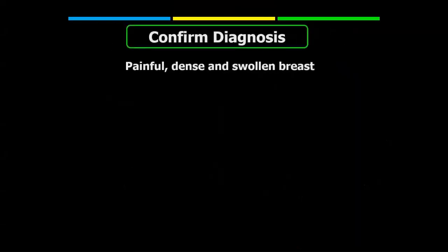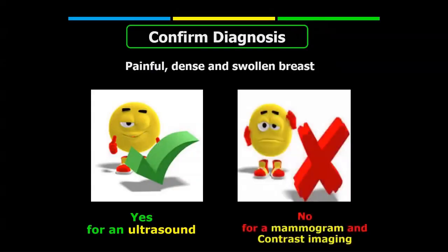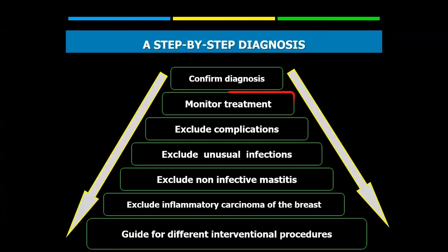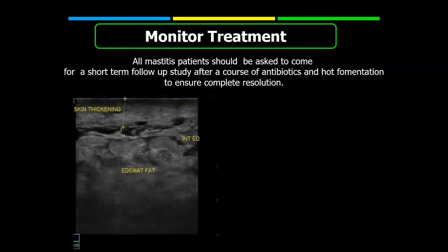So to confirm the diagnosis of mastitis, we have to remember that we have a painful, dense, and swollen breast. So we will say yes, go for an ultrasound examination, and no, do not perform a mammogram or any sort of contrast imaging early in the course of mastitis. We'll move another step downwards: the patient was diagnosed, she's receiving treatment, and we have to monitor this treatment. All mastitis patients should be asked to come for a short-term follow-up study after a course of antibiotics and hot fomentations to ensure complete resolution.